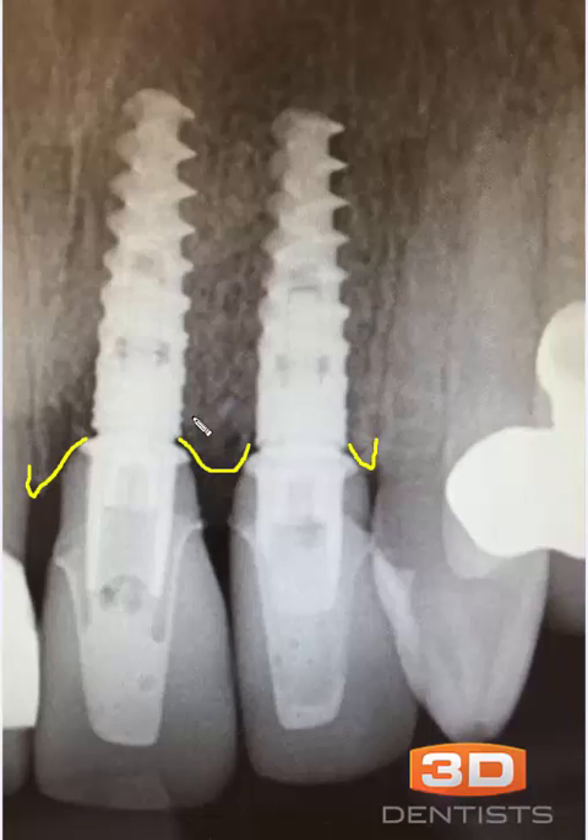That same rule also applies to the abutment itself. In a situation where our abutment is here, our bone still goes to right here. Anything that invades that one and a half millimeter space up to this point can cause that bone to resorb. In my opinion, this part of this abutment right here is invading that space.